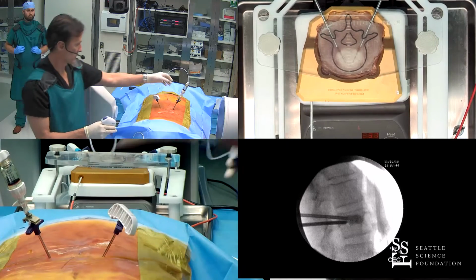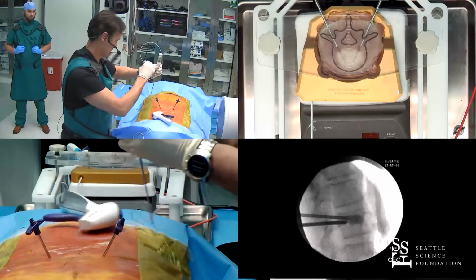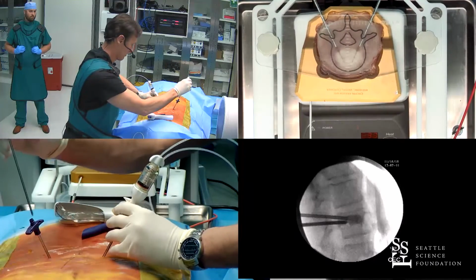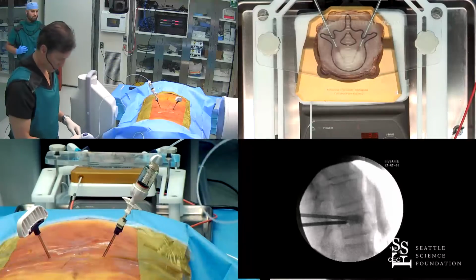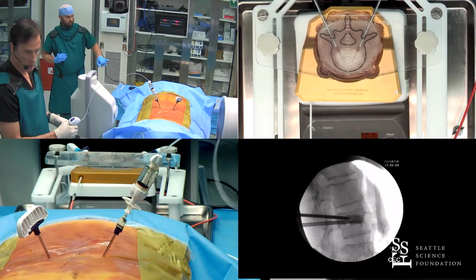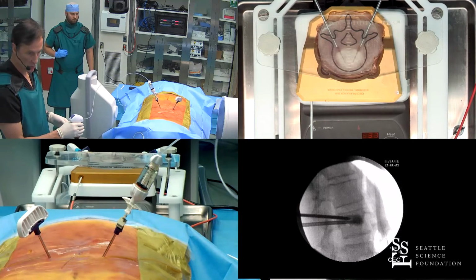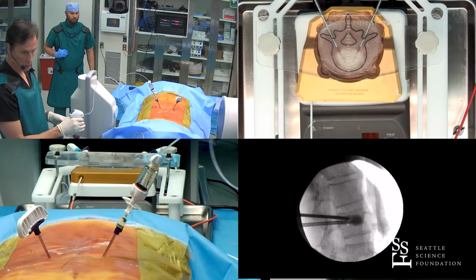All right. Go to the other side. And we'll have to use the double shadow of the cement to be able to see it. So we can see one set of the cement on the other side through the first cement.